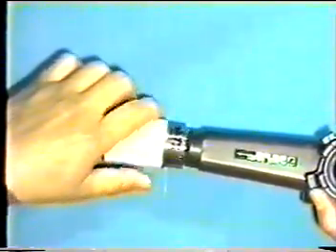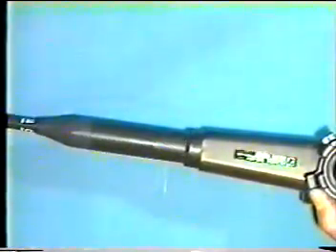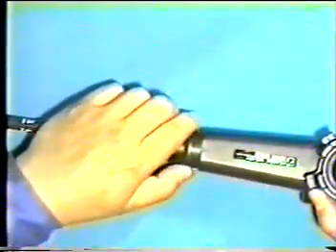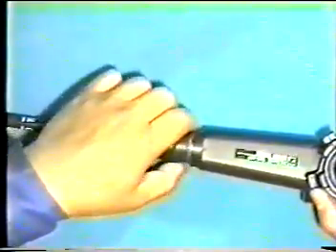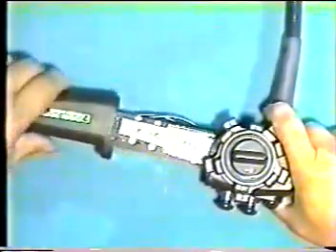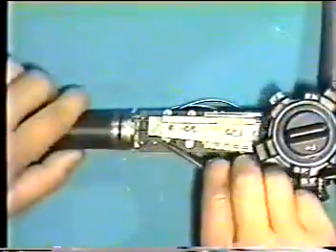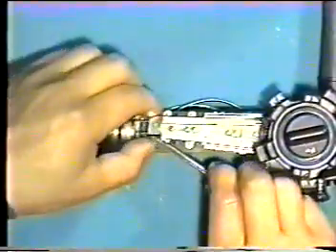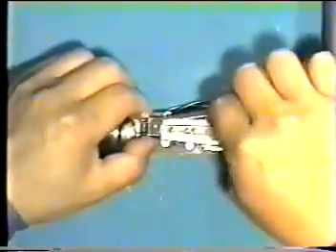Remove the ring from the holding cover with a dedicated spanner. Extract the holding cover. Then let us explain how to disassemble connecting portion of the angulation wires. Remove the guide cover first.